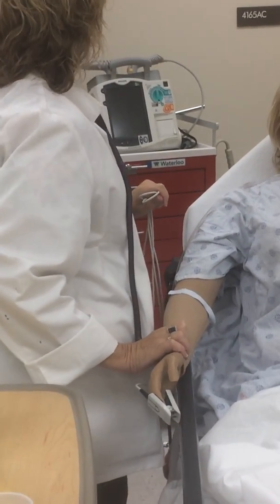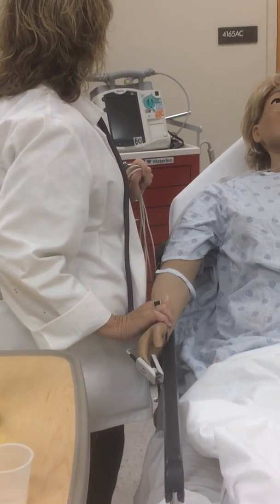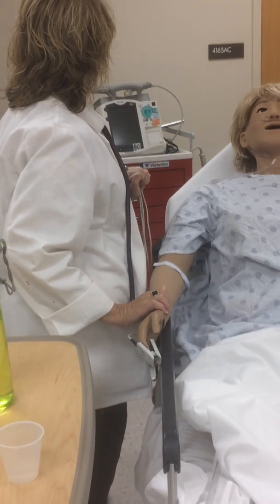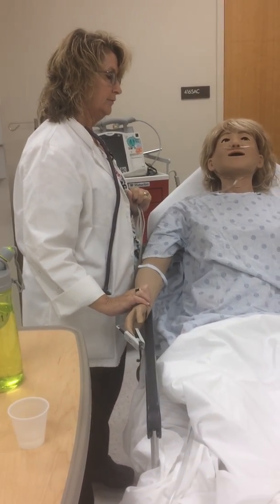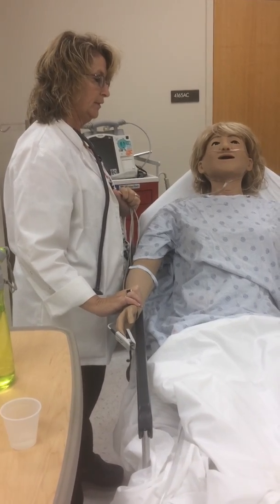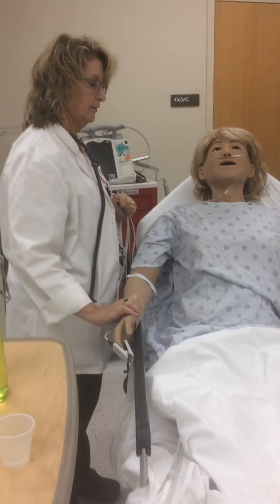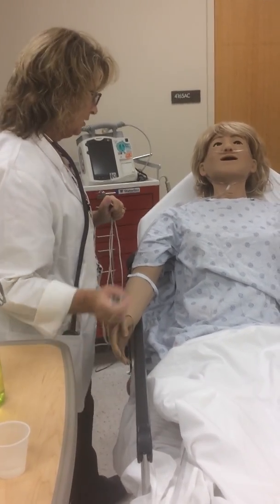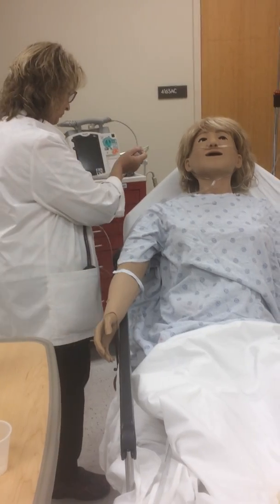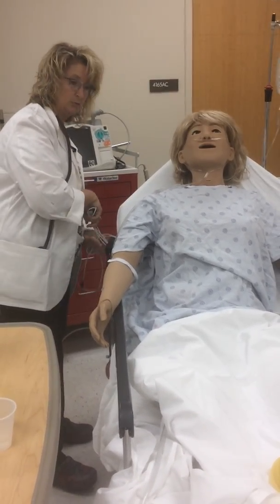Okay. And respirations. Okay, so we've got 130/80, we've got a pulse of 80, we've got a respiratory rate of 20, and we've got a SAT of 98%.